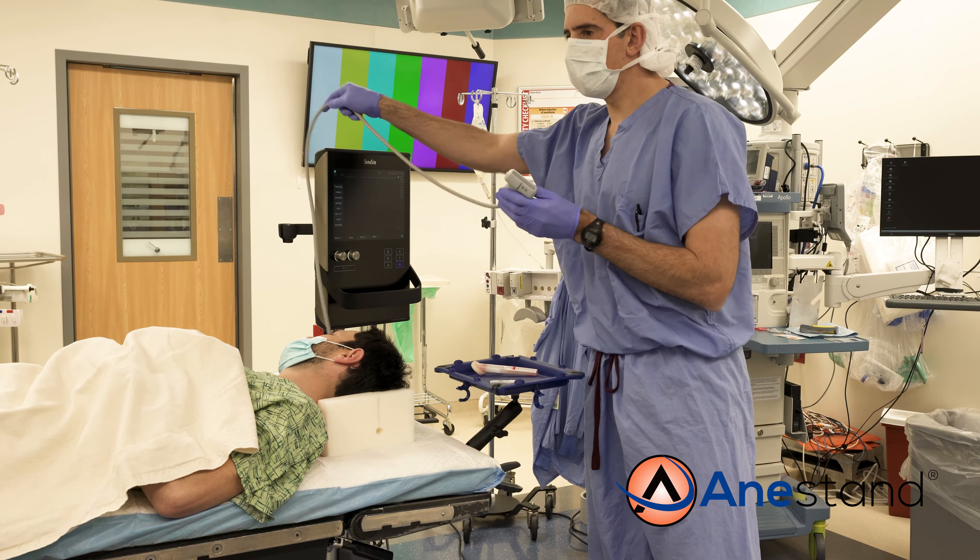Some would put it over their shoulder, others would drape it over the ultrasound machine. Anastan provides a better solution — simply slide the cord into the corner grip of your tray, and now the probe feels much lighter.